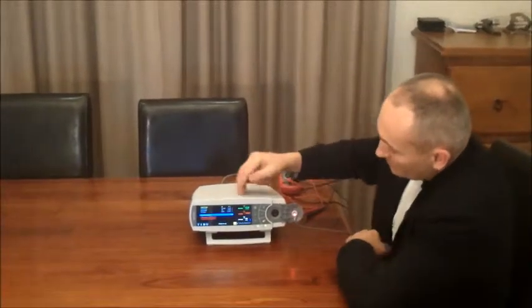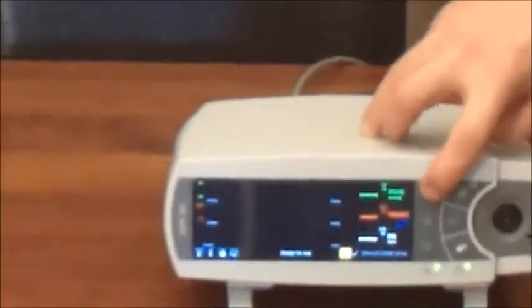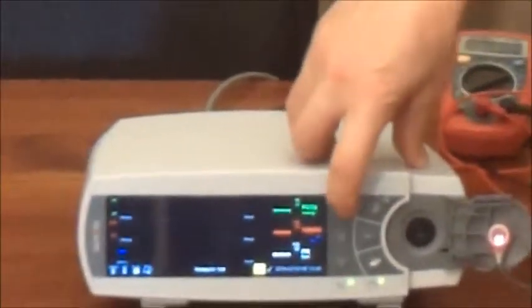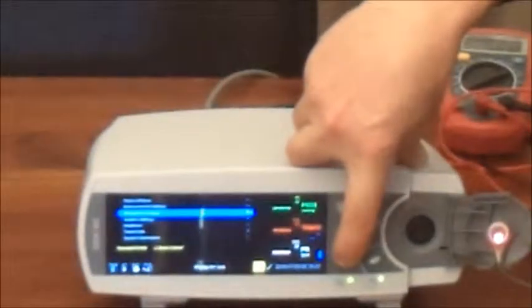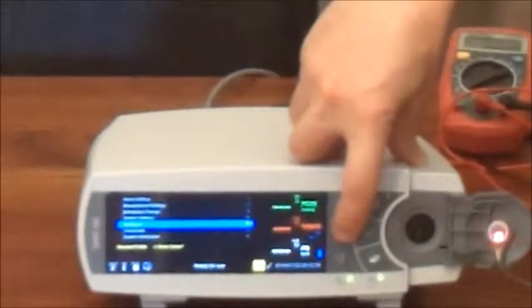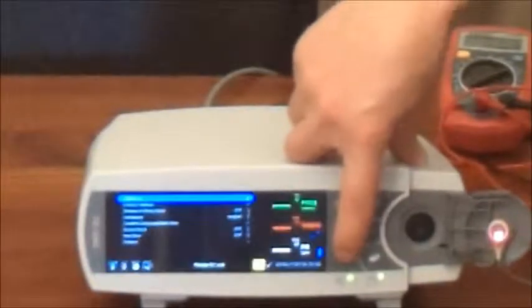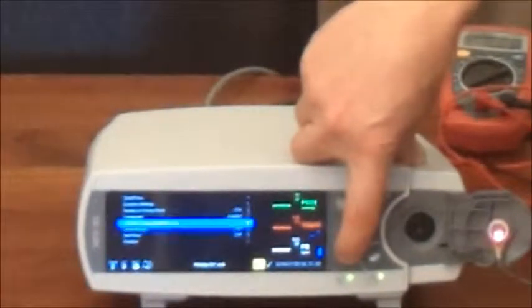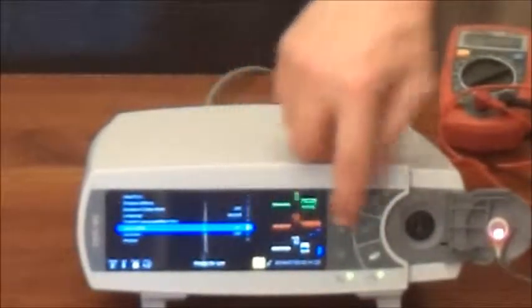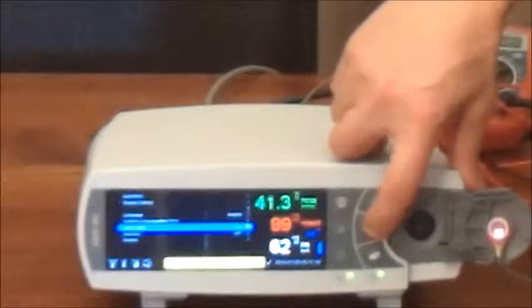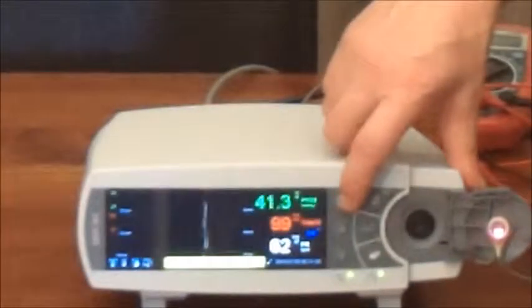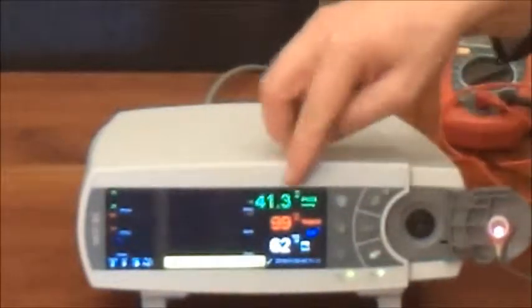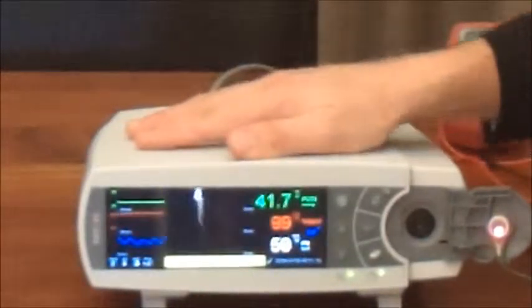The way we check them is just to go back through the menu to the main menu and we put it in demo mode. It's in system settings, and then down to demo mode which is there. Enter. We now have a little double-headed arrow; we move that up to turn it on, enter, go back to the main screen.